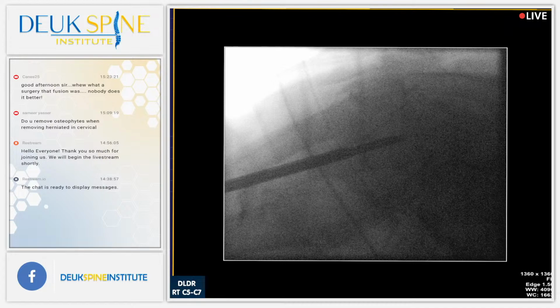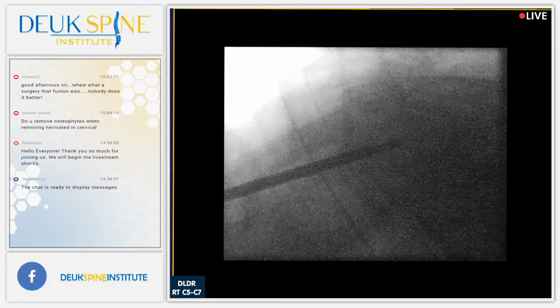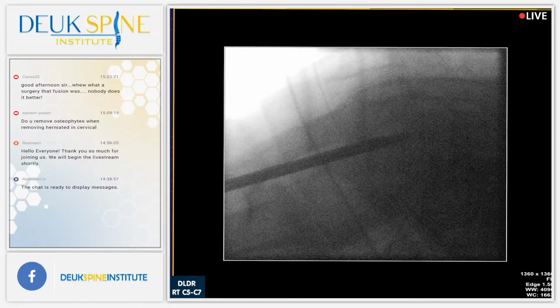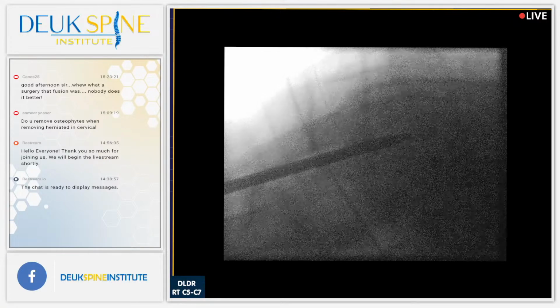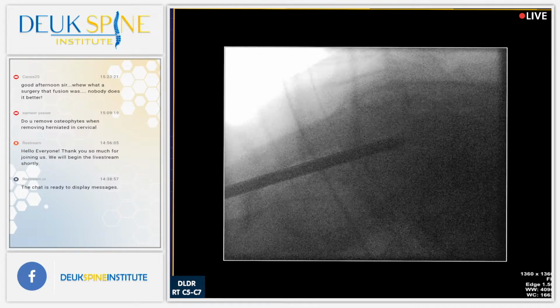Shot. I feel the tube sliding. Give me that inline traction, Berndes. Come on. It's not the time to quit. Almost there. I feel it moving. Definitely making progress here. Can't believe it. Let me put the dilator back in. It's the hardest I've ever done.